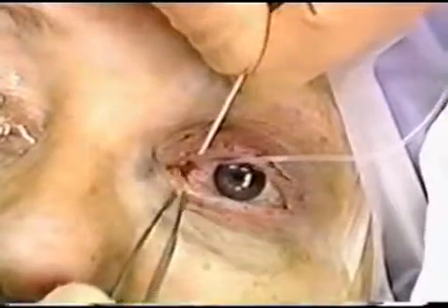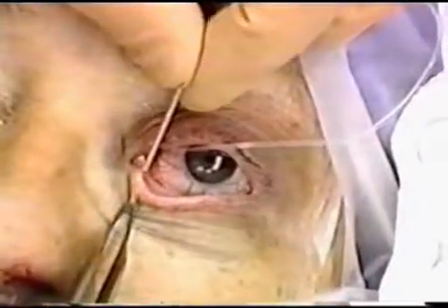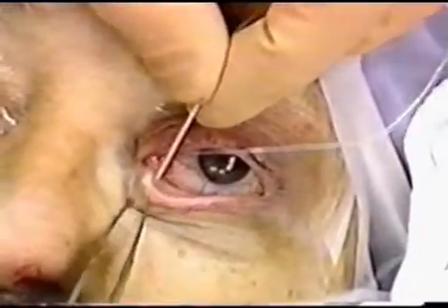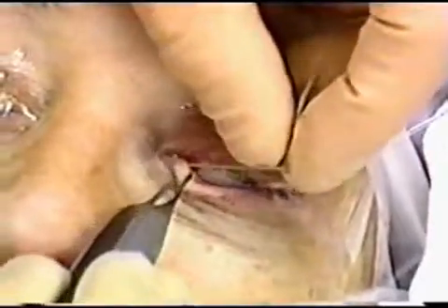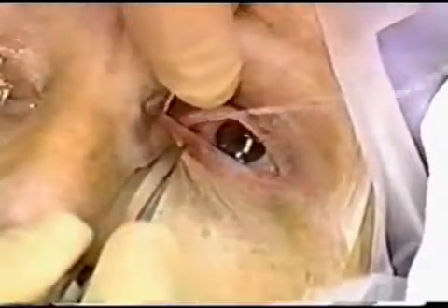The small diameter end of the stent with the enclosed short probe is now inserted into the inferior canaliculus, lacrimal sac, and DCR ostium into the nose.